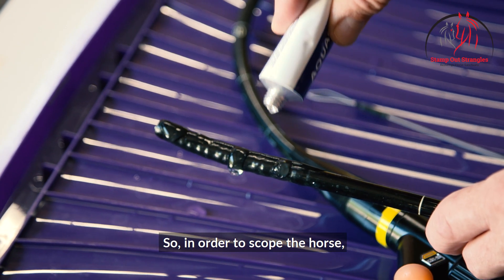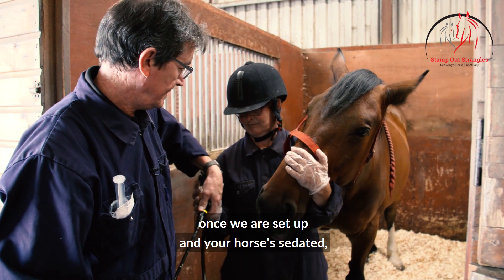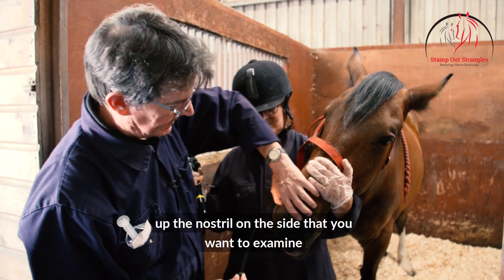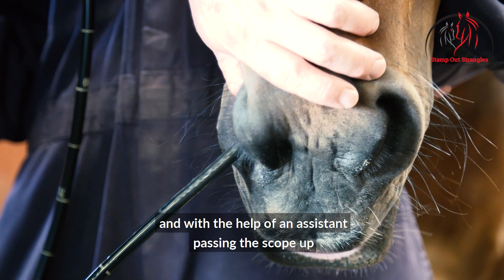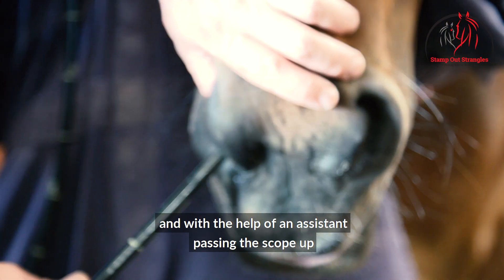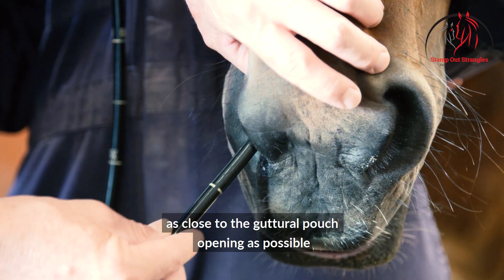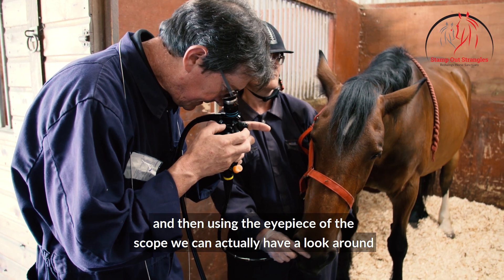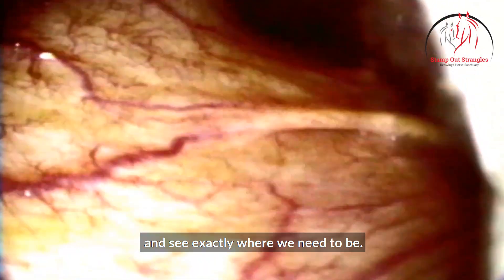In order to scope the horse, once you're set up and your horse is sedated, it's then a case of passing the scope up the nostril on the side that you want to examine. With the help of an assistant, you pass the scope up as close to the guttural pouch opening as possible, and then using the eyepiece of the scope we can actually have a look around and see exactly where we need to be.